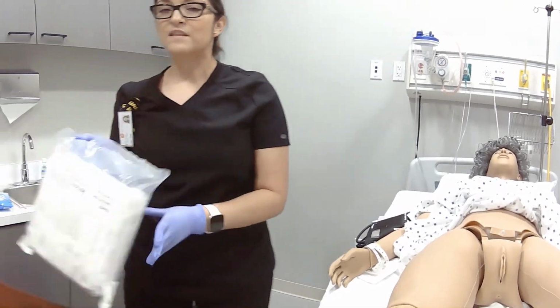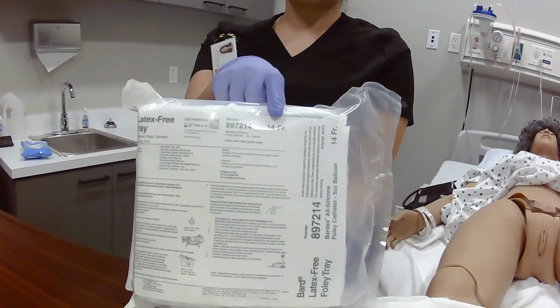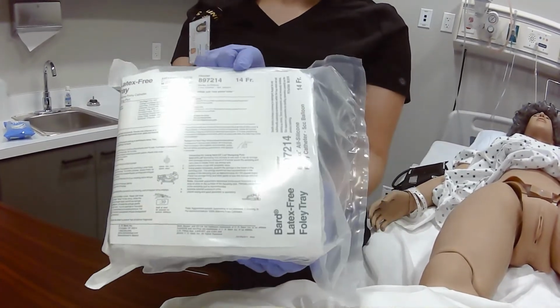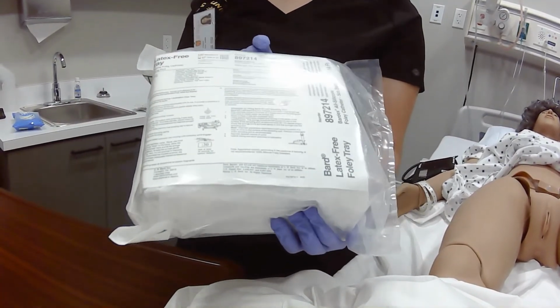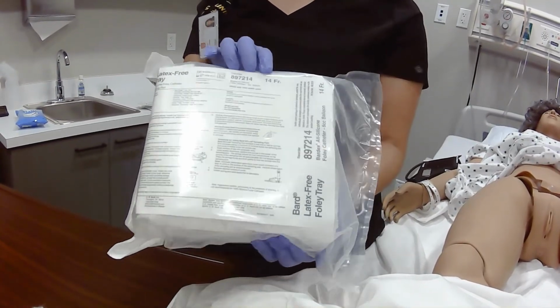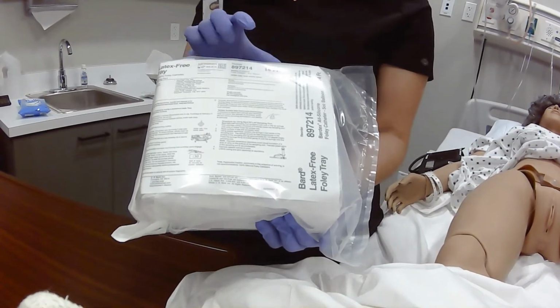Okay? The kits come in different sizes. So catheters, Foley catheters, come in different sizes. So this one is a 14 French, which is average for a female. They're different sizes, so usually 14 for females and males. 16 French is a little bit bigger, and 18 French I think is as high as it goes.